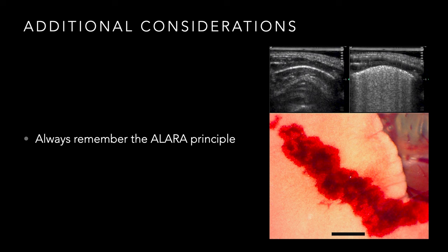And what's interesting is none of this has been replicated in humans, but it's feasible, right? That enough energy over enough period of time can potentially cause some pulmonary capillary hemorrhaging in the lungs, right? And for most people who are young and healthy, and if you're just talking about such a small focal spot, you have a small little bleed and it heals and you get to be better. And you'll probably clinically never even know this.